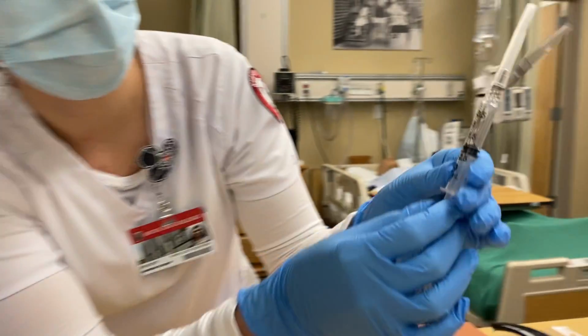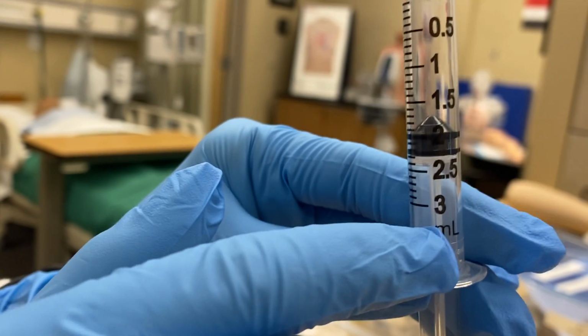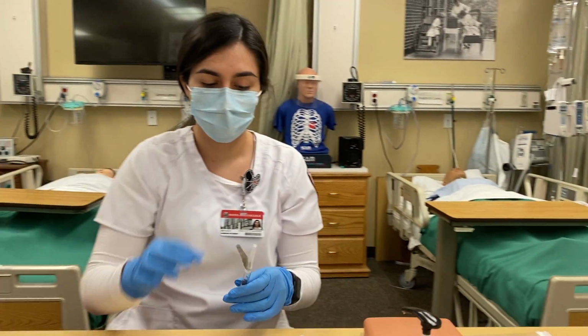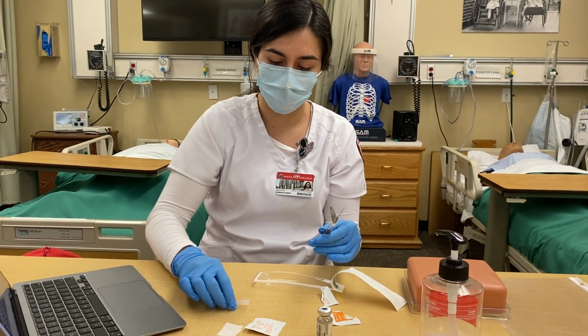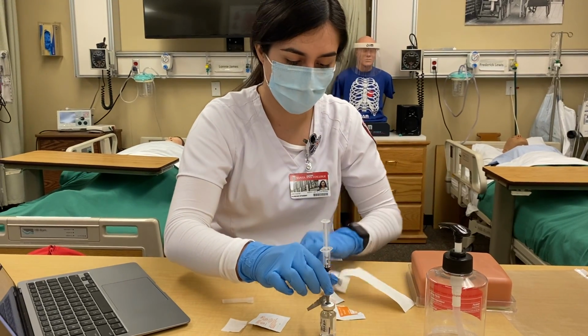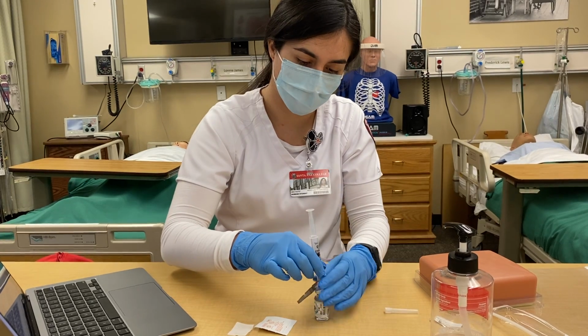So this is 2 mLs right here, because this is an ml. I'm going to do the air first. Okay, I'm going to take this off. Okay, I'm going to put in my air.